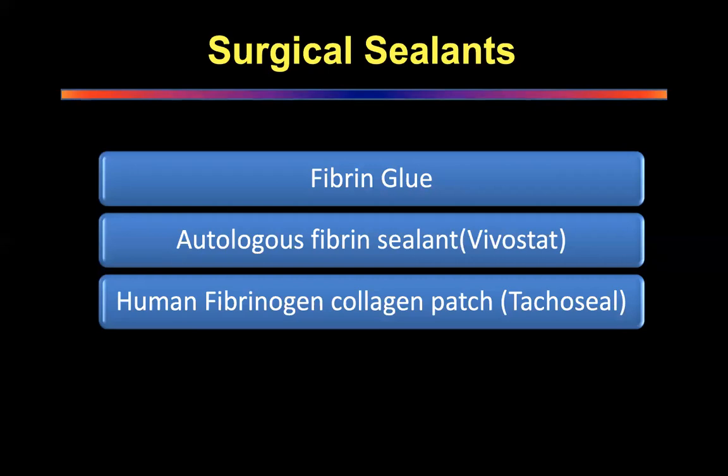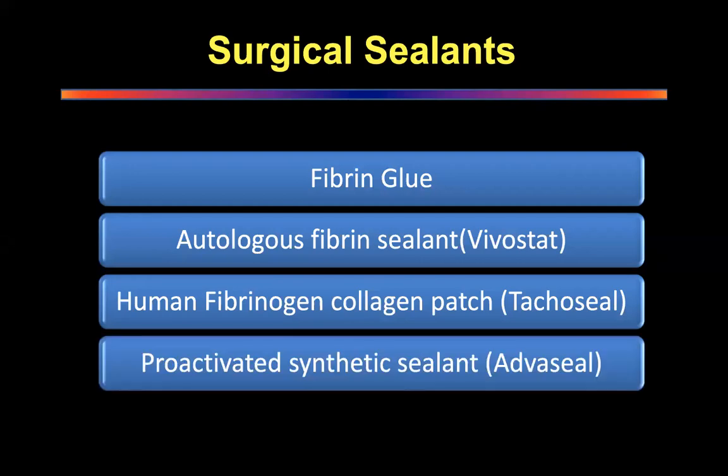In fact, it's a very good tool even for stopping bleeding. So a lot of people use it. The Japanese particularly use a lot of Tacoseal for thoracic surgery.